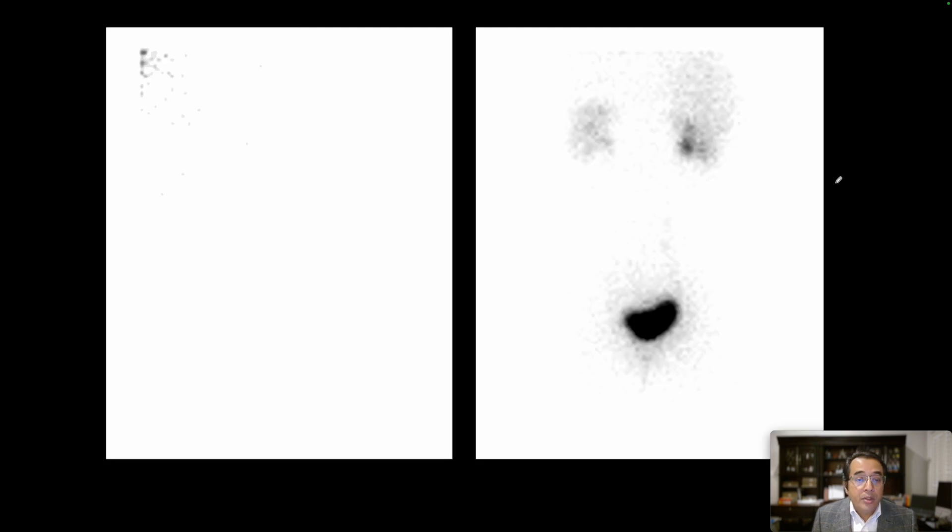Our next slide is showing dynamic images from a renal scan using technetium 99M MAG-3. So we frequently use MAG-3 renal scan, especially to evaluate patients with obstruction. We're looking for any focus of stasis.